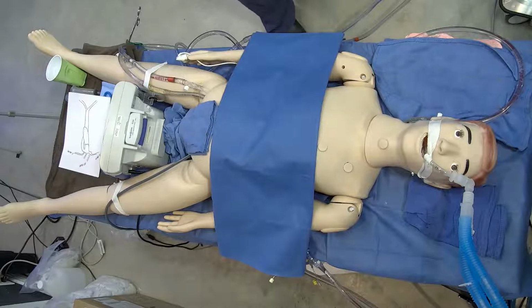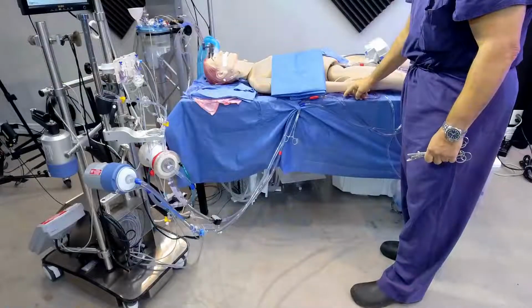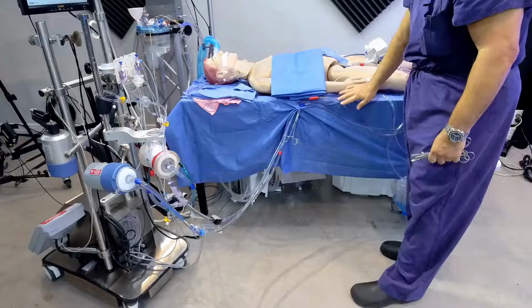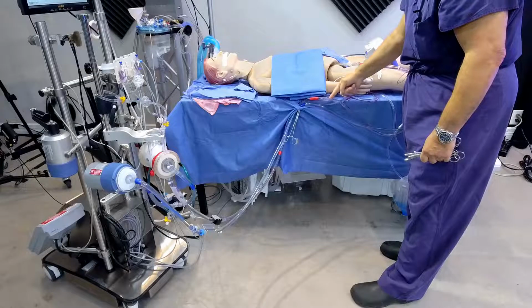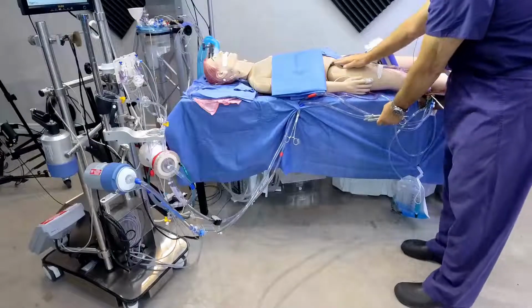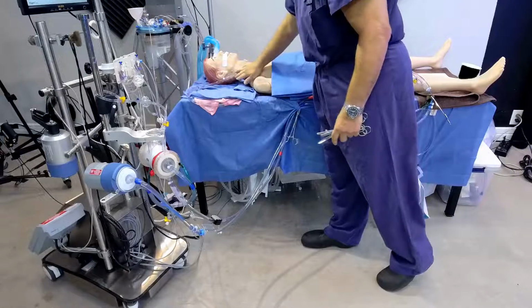But let's take a look here at the circuit. So we have put a Y connector in here. Can we go to the Bevo camera 7? Perfect. And I don't know if you can focus in on this or no? No? Okay. So here's our Y connector here. We have our return coming from the oxygenator, which is arterialized, and it is split. Some of it is going this way into the femoral artery, and the other is coming this way up into the right IJ of the patient.